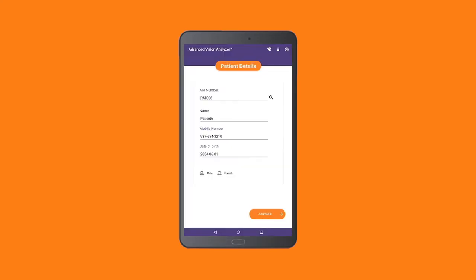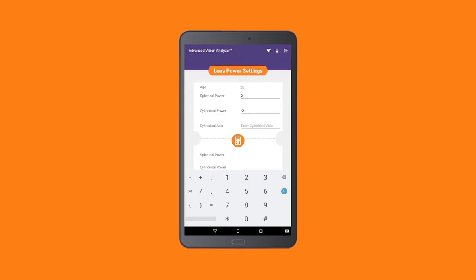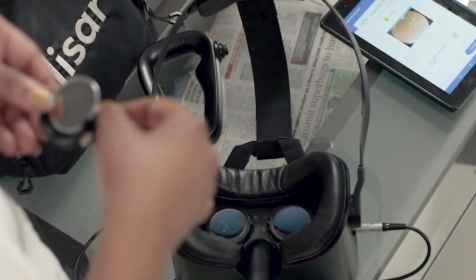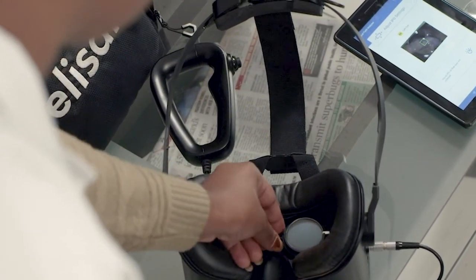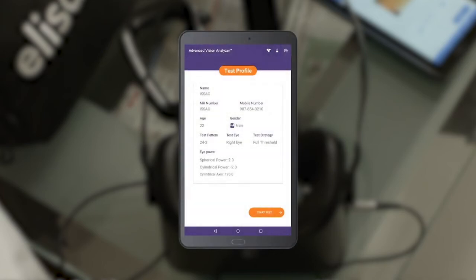The next step is to calculate the lens power required for the patient to undergo the test. Enter the spherical power, cylindrical power, and cylindrical axis, and press the orange calculator button. Then place the calculated trial lens power into the correction lens holder. When this is complete, click Continue on your controller tablet. You will see a screen summarizing the patient details to verify that the information you have previously entered is correct.